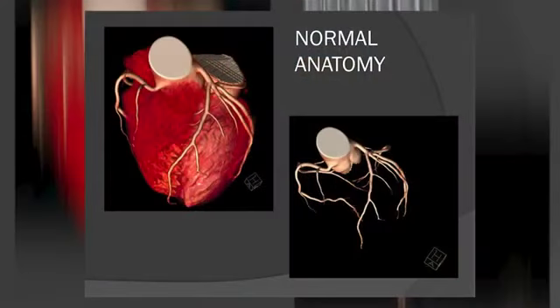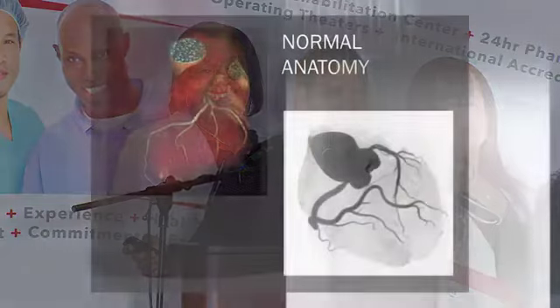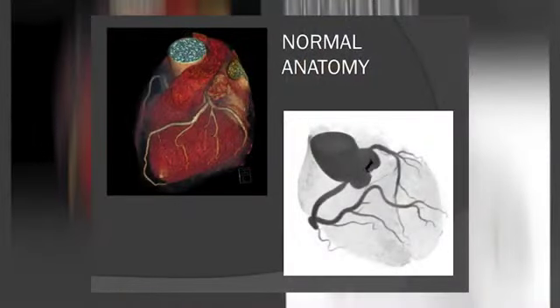And this is all because technology has evolved to this point where it can do this. And we all know that. We go and see our superhero movies. You don't even know what's real, what's not nowadays, right? Everything looks real. So the left main, the LAD, the diagonals, circumflex, the obtuse marginal, the RCA, the acute marginal, the sinoatrial branch. We can take out the heart. We can just leave the coronary tree there, see? Subtraction. So it allows you to manipulate your images in great detail.